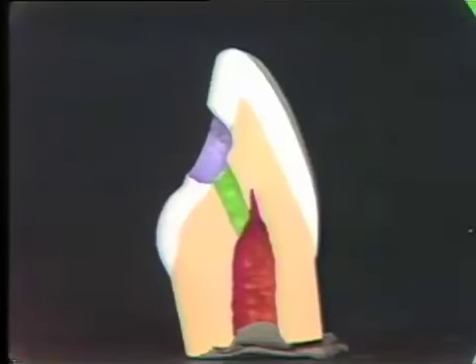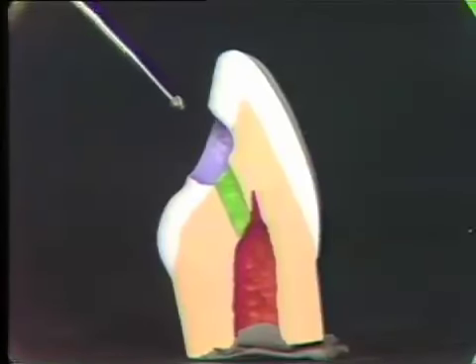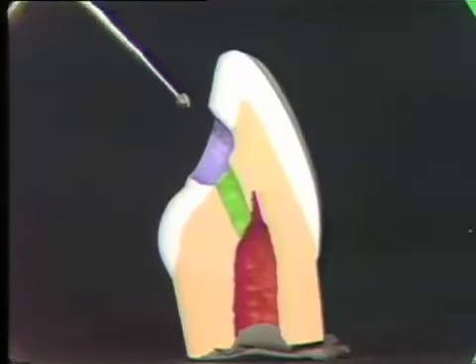The next step is to connect the outline form that you established with your high speed with the pulp chamber. In this step, you use the number 4 low-speed round burr in your low-speed handpiece. You change the angulation of the handpiece so it will cut down the long axis of the tooth.